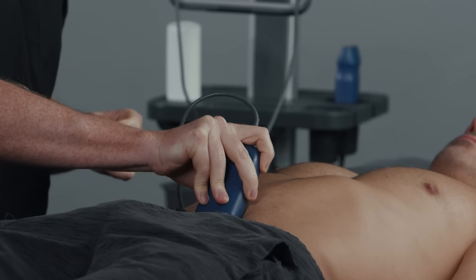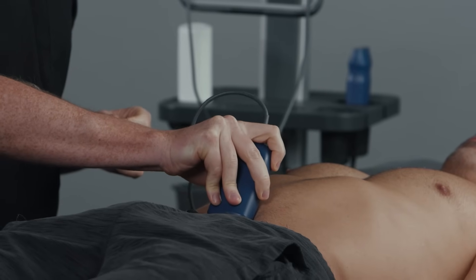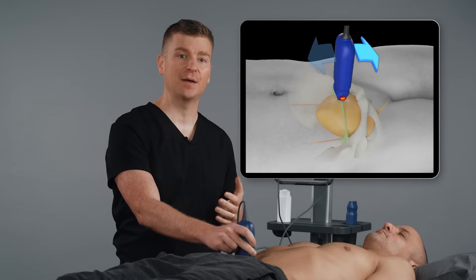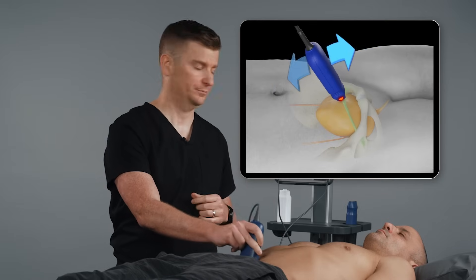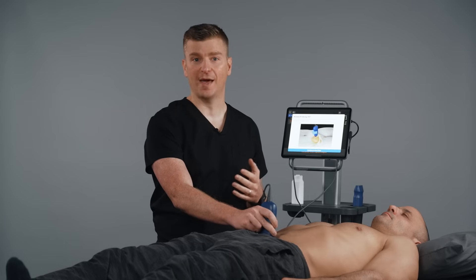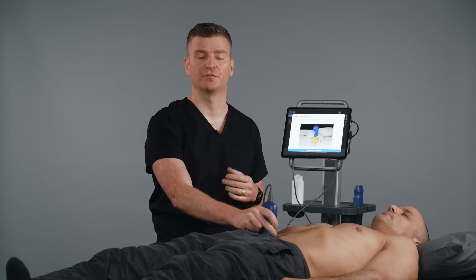Fanning the probe is when you gently tilt the probe back and forth along the axis in this motion. To complete this step, in the transverse view, fan from head to toe. If you're conducting a post-void scan, no fanning is needed. The AI will automatically take a picture and measure where it sees the largest cross-section of the bladder.